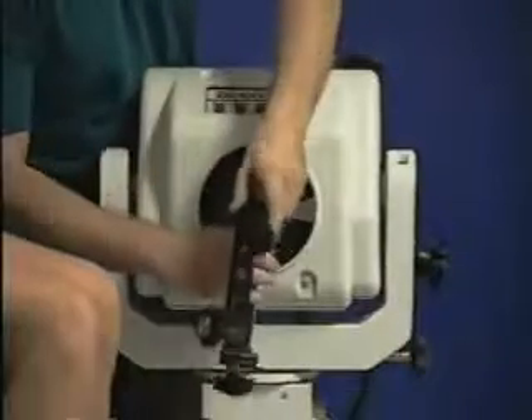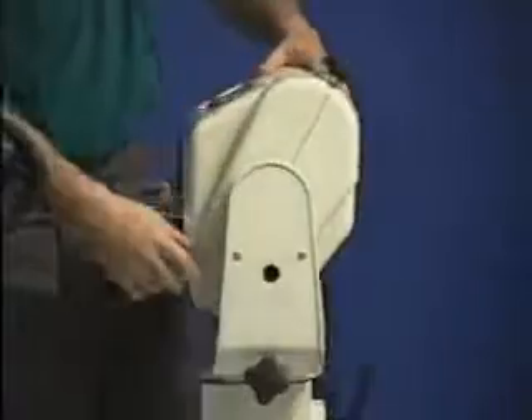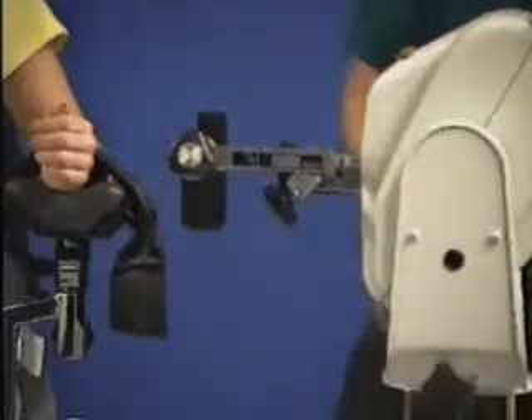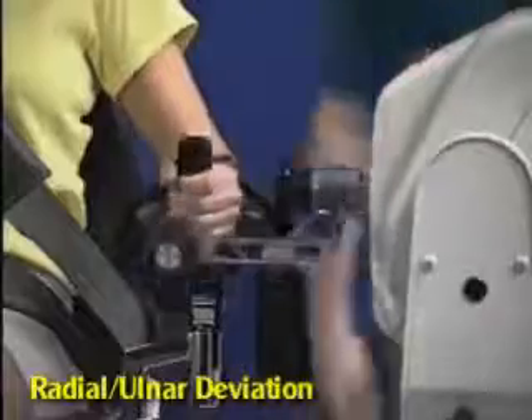Install limb support and secure arm, aligning the red dot. Attach wrist attachment, making sure hand grip is angled up. Rotate the chair to zero degrees and the dynamometer to zero degrees. Slide dynamometer into position and raise to align axis of rotation. Move patient into position and set range of motion stops.